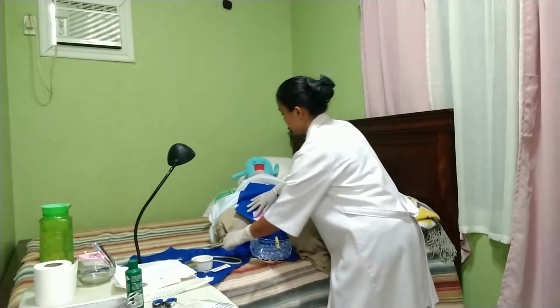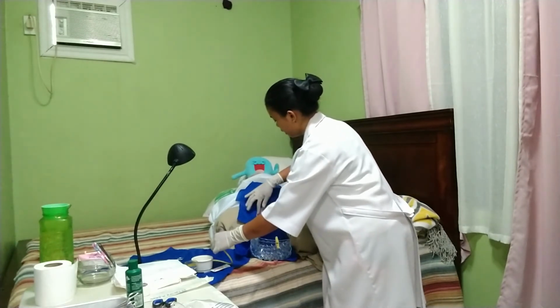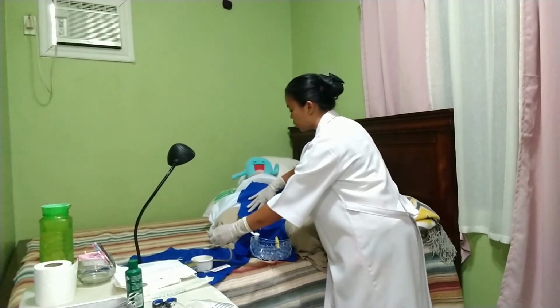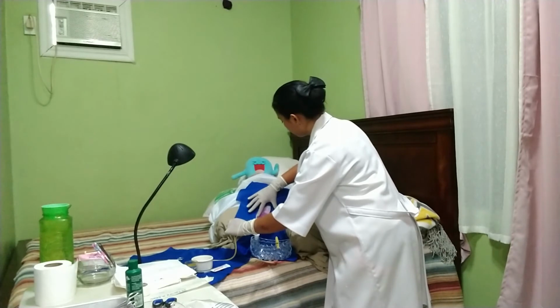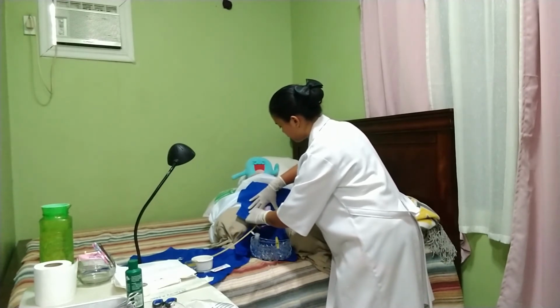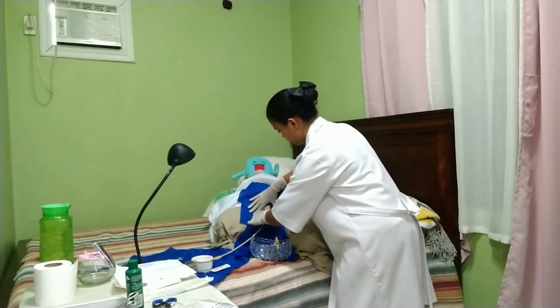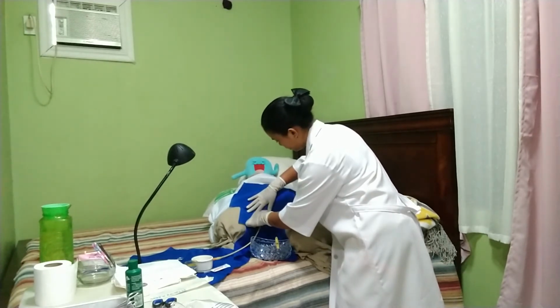Miss Angelina, I'm going now to start with the insertion of the catheter. I need you to bear down like you're trying to void because that will relax your external sphincter muscle. Take a deep breath, slow deep breath, okay? It will be a little bit uncomfortable, but it will pass soon. Alright? Okay. Take deep breaths, Miss Angelina. I know it's a little bit uncomfortable.